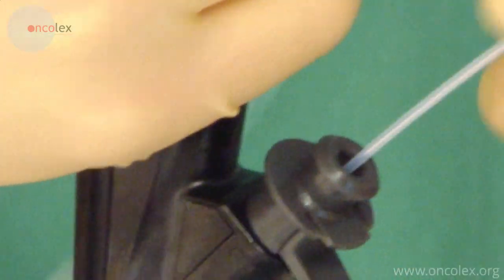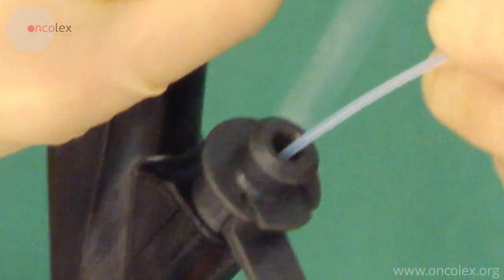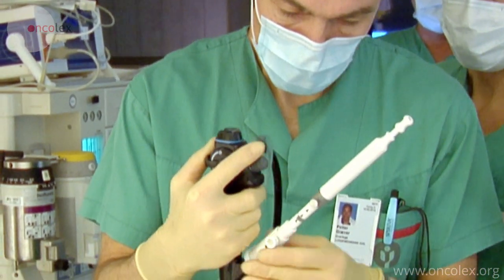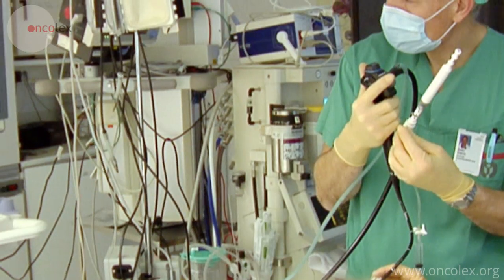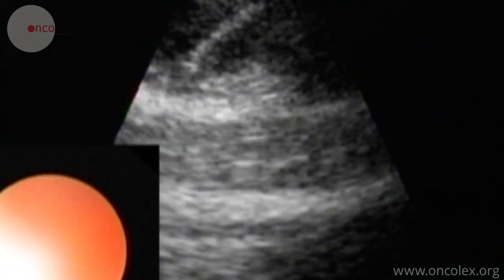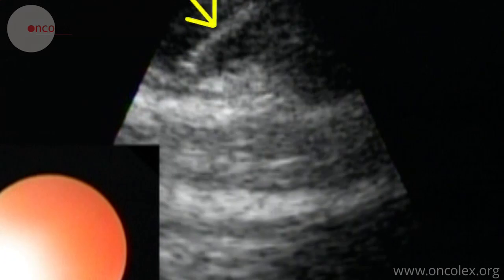The aspiration needle is placed in the working canal in the scope. Guided by ultrasound, the needle is inserted into the lymph node. This is the needle in the lymph node.